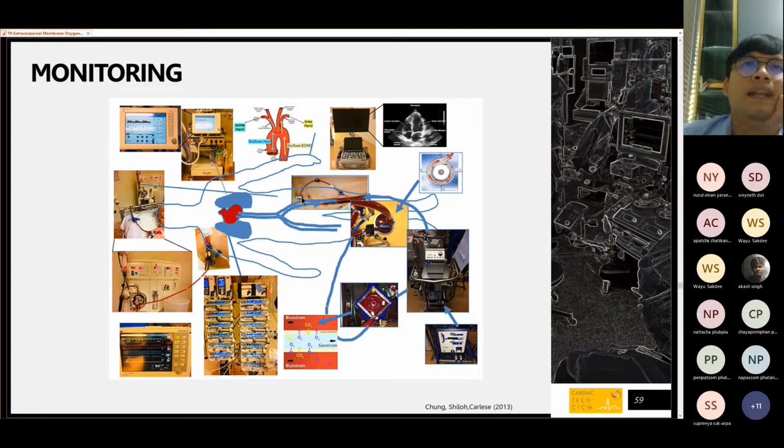If you see, there is another smaller cannula, a smaller extension line here, connected with the arterial side, the arterial line. This kind of cannula is going to provide blood support to the distal part, as I mentioned earlier. So imagine that we drive the blood to the descending aorta here.